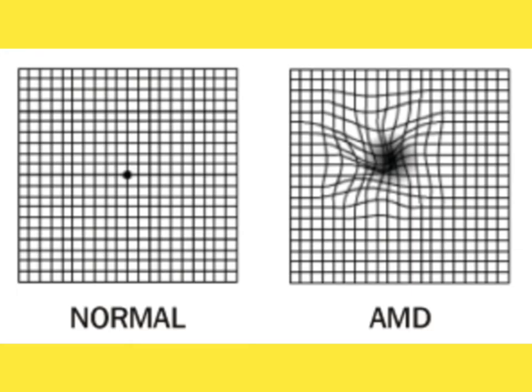Now let's move to this area. Here you can see this is the normal Amsler grid reading, if the patient is having normal vision, but here you can see there is AMD. So due to that AMD, you can see there is a distortion, and also a blackish appearance of this area. As you all know, the main symptom of AMD is central vision defect, as it affects the macula mainly. Okay, so AMD is due to smoking or alcohol consumption. These all lead to age related macular degeneration, and the most common is dry, and its severe form is wet ARMD. Okay, so this is the case of AMD.